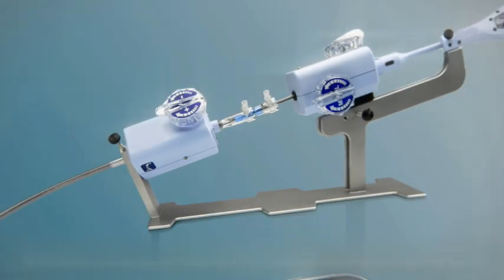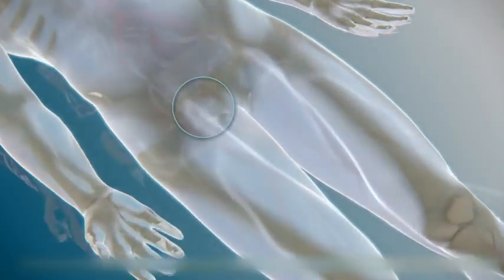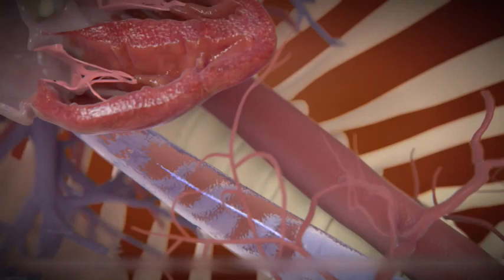MitraClip is a unique, highly maneuverable trans-catheter system for mitral valve repair. This procedure avoids cardiopulmonary bypass using a minimally invasive venous approach and trans-septal puncture to gain access to the left atrium.